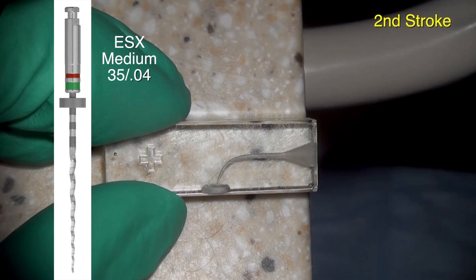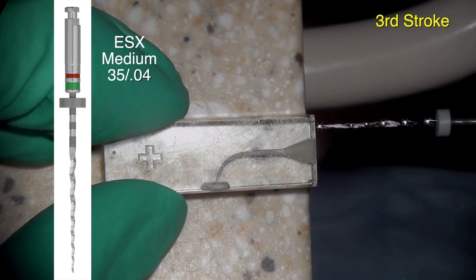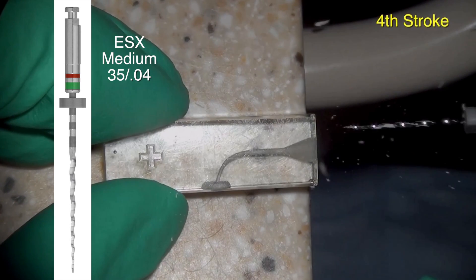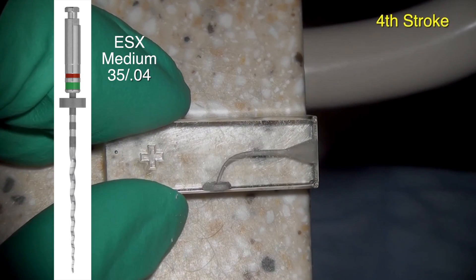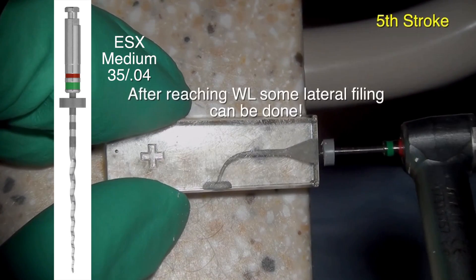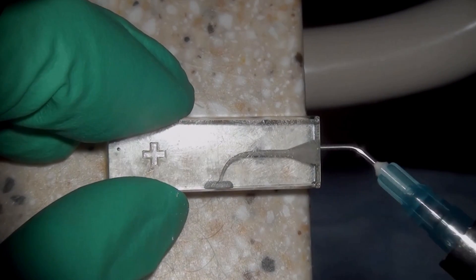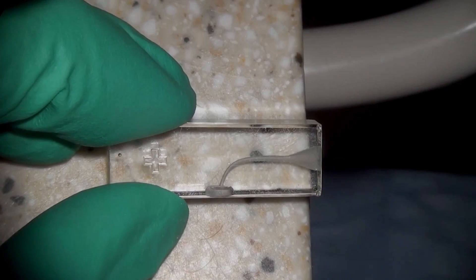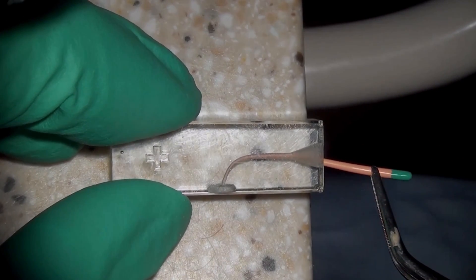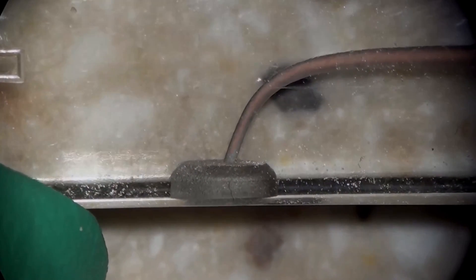You can see here we're already doing the third stroke. On the fourth stroke we're getting closer to full working length. As the operator, you would be monitoring the stopper and its relative position to the reference point. After the fifth stroke, we've already reached the apex. We're just drying the canal, and one of the beauties of the SSC motion is that you're actually removing the debris — so irrigation in these blocks doesn't seem to be required, though of course you do irrigate in the real patient.